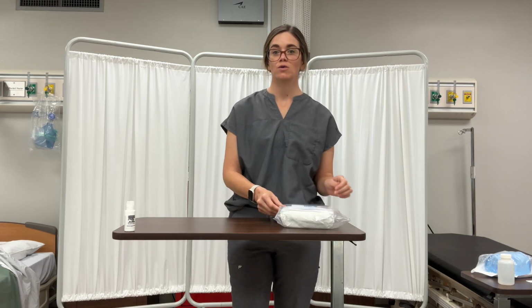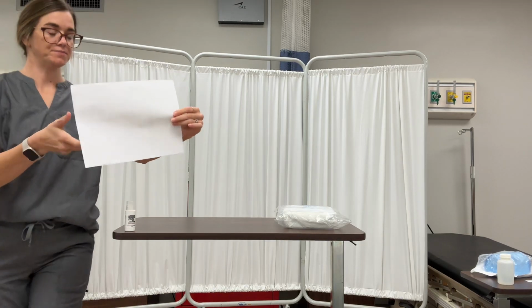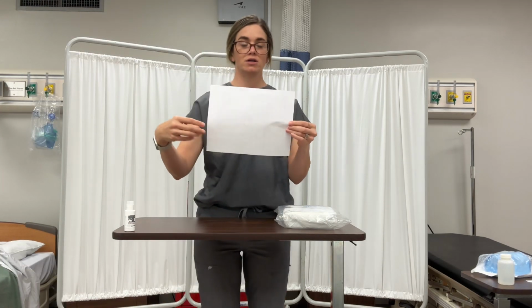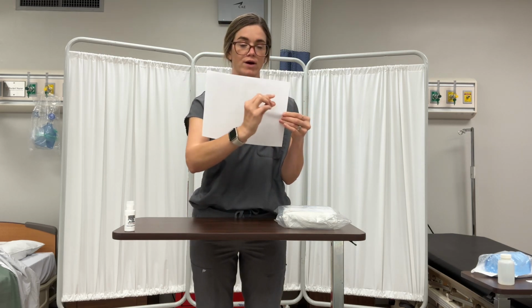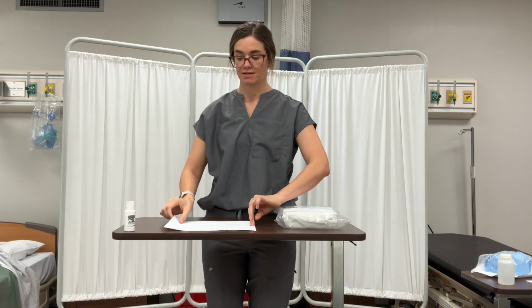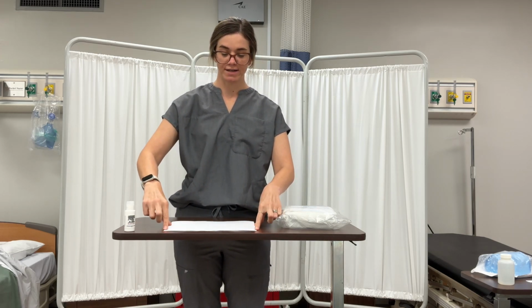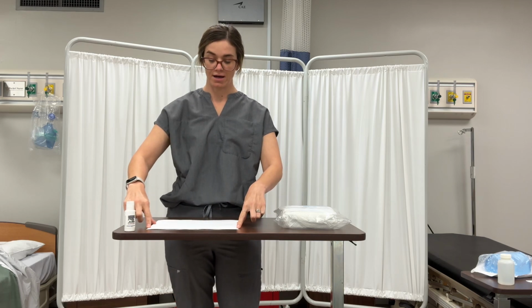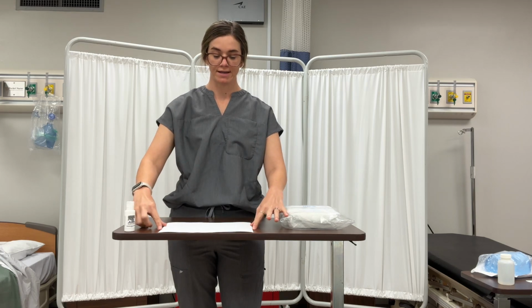So I'm going to use this paper real quick. If this sheet of paper is your sterile field, you have an imaginary 1-inch border that goes all the way around. If we lay this flat, I can touch this 1 inch here, and I can move it around, but I won't be able to touch in the center because that is sterile. So you have 1 inch all the way around.